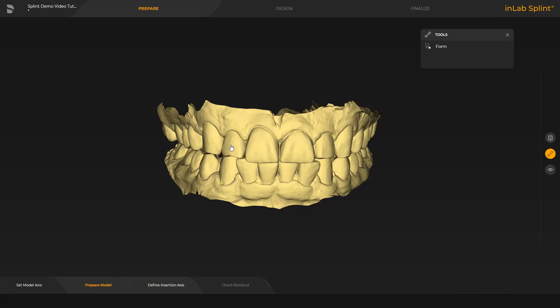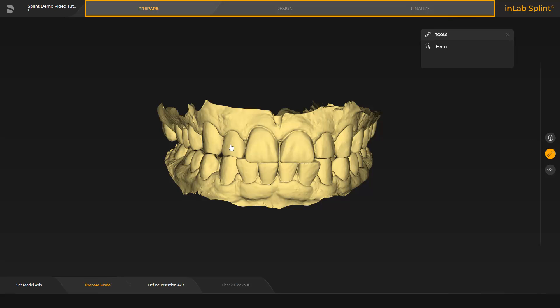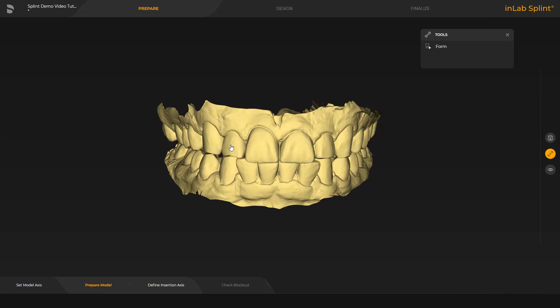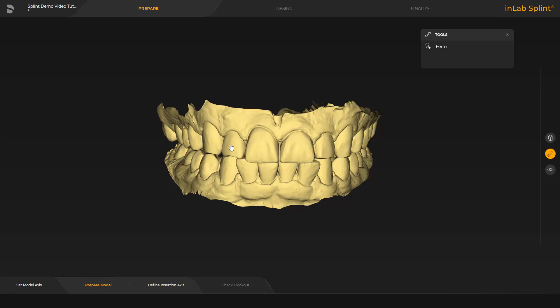In the splint app, there are three phases. We start in the prepare phase with the prepare model step. In this step, material can be added, removed, or smoothed with the form tool.